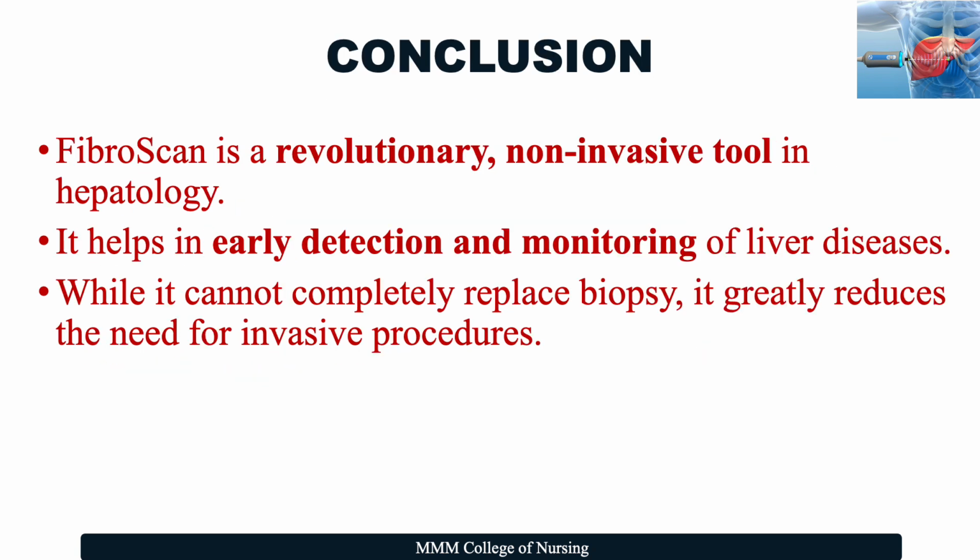In conclusion, Fibroscan is a revolutionary non-invasive tool in hepatology. It helps in early detection and monitoring of liver diseases. While it cannot completely replace biopsy, it greatly reduces the need for invasive procedures.